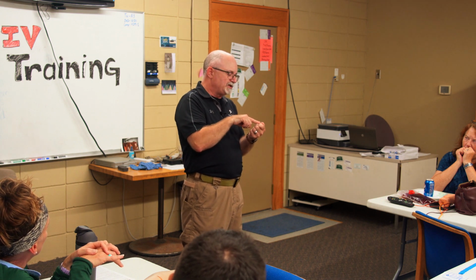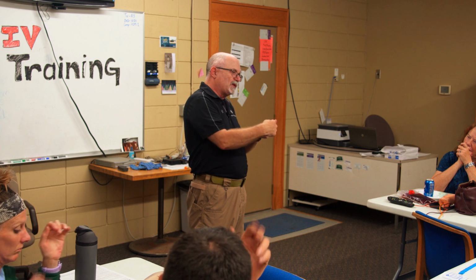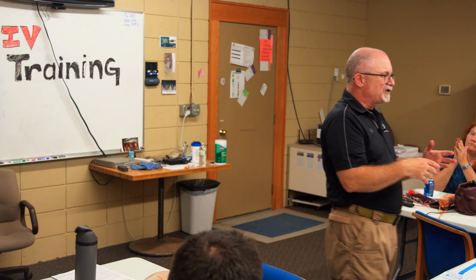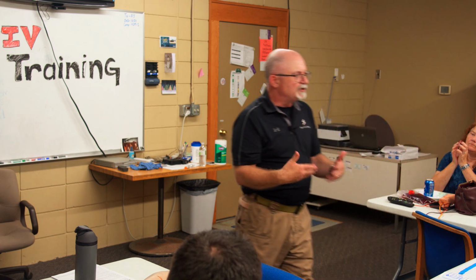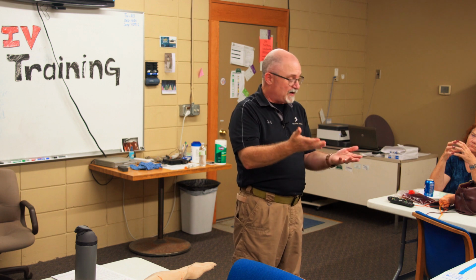Occasionally when you're trying to put your catheter in, you could bump up against a valve, and you won't get much of a flow because there's not enough pressure to get through and open that back up again, or it's pushed right up against the tissue of the valve itself. So that's not a complication, it's just something you can get into trouble with, or it just won't flow. I had to squeeze the bag to force it open. Right. And so occasionally, once you get the flow going, then it's fine.